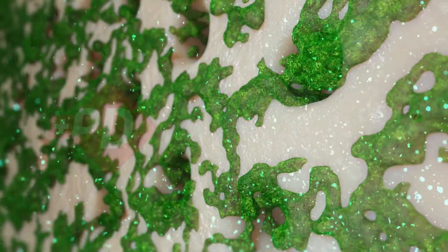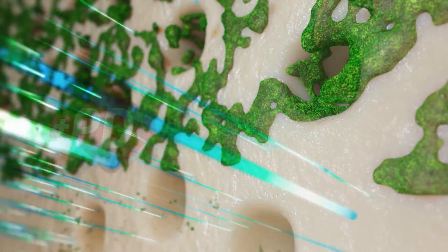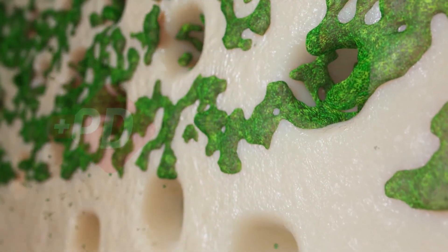In addition, the powerful horizontal flow provides high levels of shear stress directly onto the root canal wall, so even the smear plugs inside the dentinal tubules are washed out.